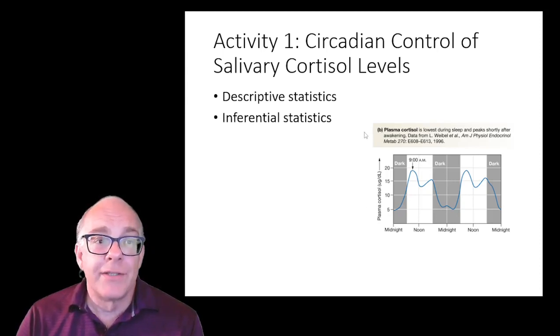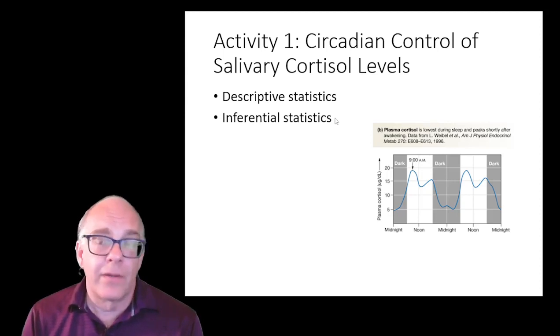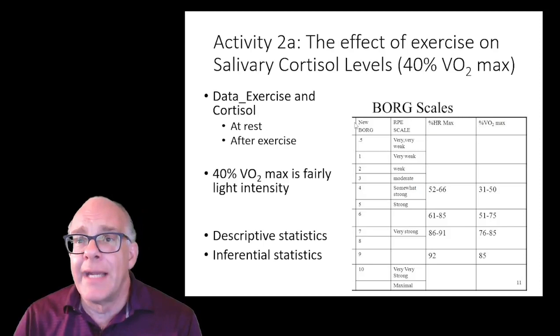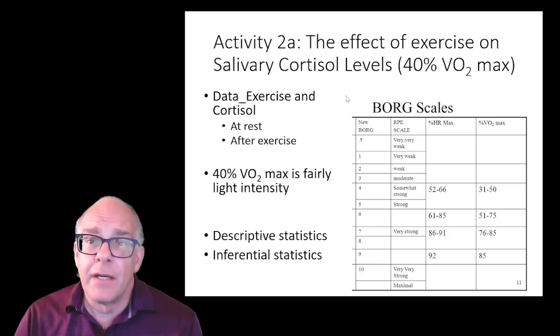Activity number 1 is going to take you through descriptive statistics and inferential statistics, basically asking: are these cortisol levels higher during the day than they are at night with our classmates? Activity number 2 adds a little additional scientific experimental evidence, looking at salivary cortisol levels in relationship to physical exertion.